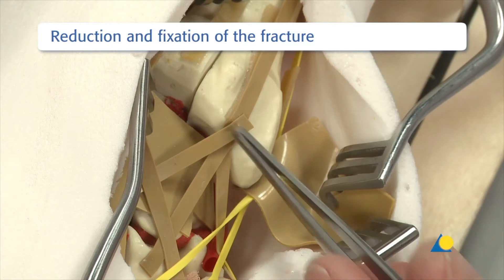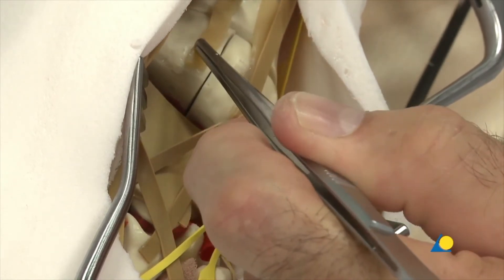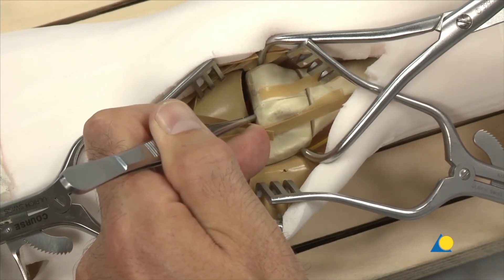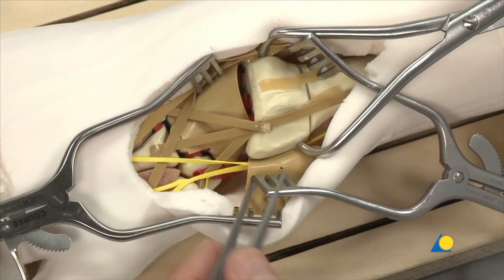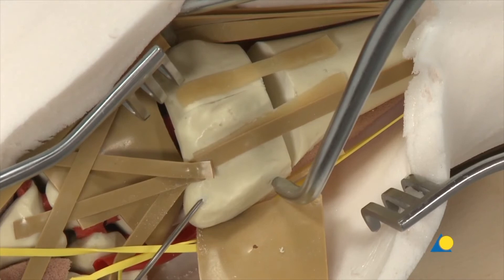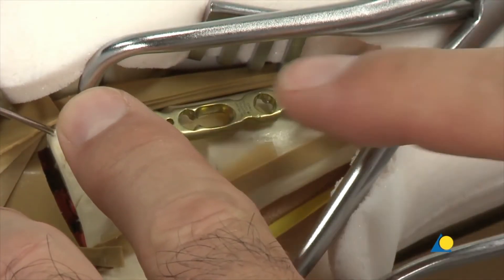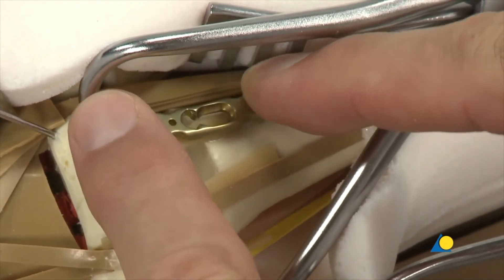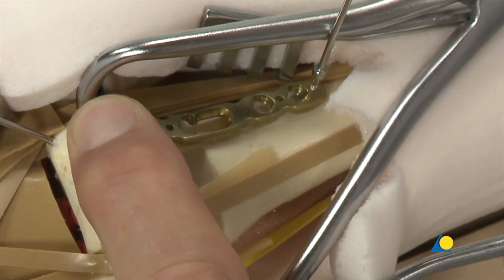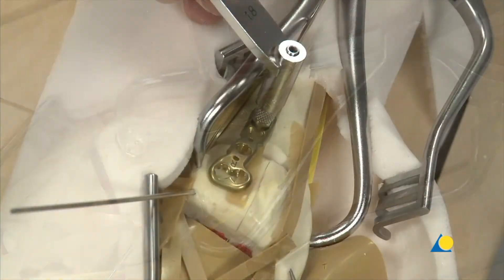The articular block is restored by reducing the intermediate column fragment to the radial fragment. The block is secured with the large pointed reduction forceps and any step-off should be corrected at this stage. The extra-articular extension deformity is corrected and the articular block is held in place temporarily with two K-wires. The intermediate column plate is applied first, the correct position is determined, and the 1.25mm plate reduction wire with small stop is used to hold the plate on the bone. The first screw inserted is a standard 2.4mm cortex screw in the middle of the oblong combi hole of the plate.